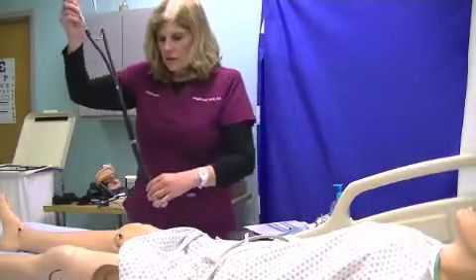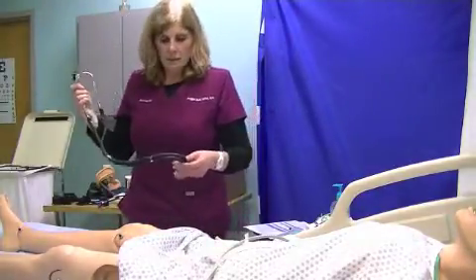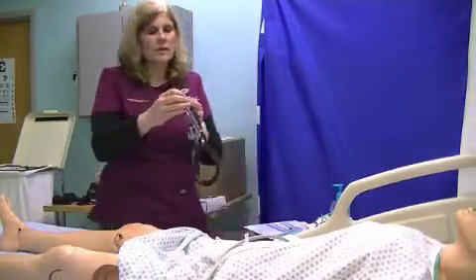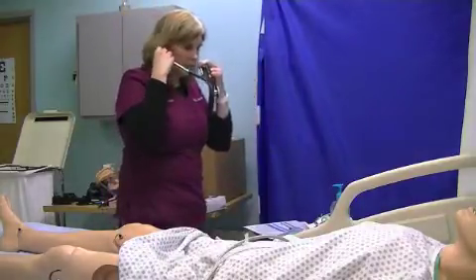You don't want your stethoscope too long, because if it's too long you might need to adjust it, because that causes it to be hard to hear. And also you're going to make sure that when you put these in the ears, they should be facing in towards your eardrum so you can listen.